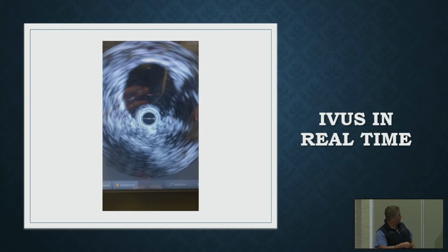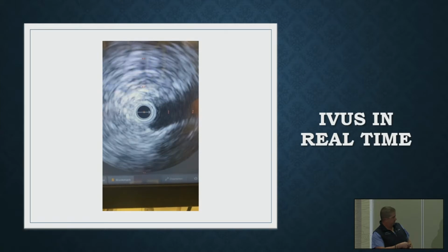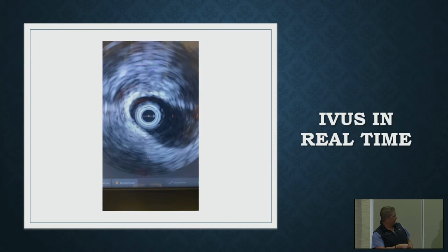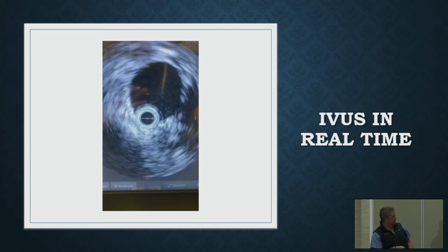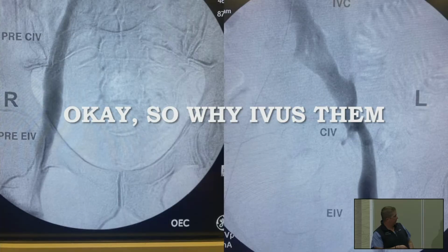So if you look at the beginning of this video, the catheter's in there and you see the compression. The vein itself is almost occlusive, the catheter itself is almost occlusive within the vein. Play it one more time.